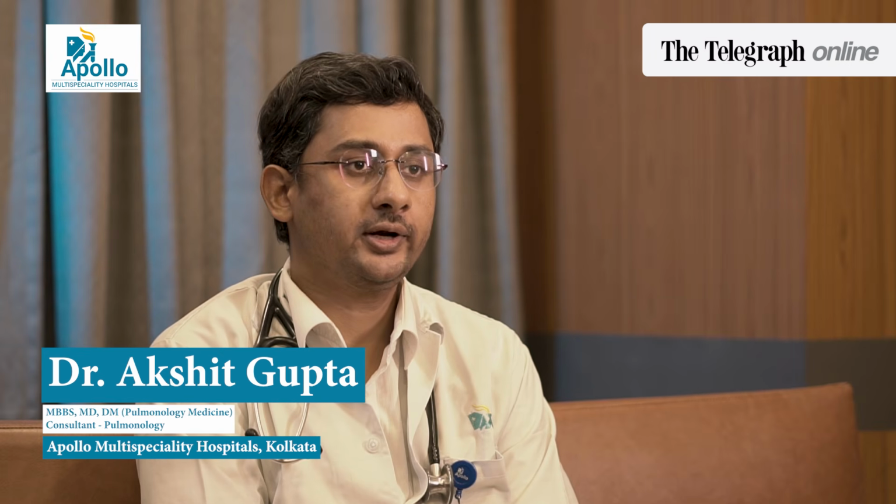I'll be talking to you regarding the two most common interventions that a pulmonologist does, that is flexible bronchoscopy and medical thoracoscopy. First, we will start with flexible bronchoscopy. Most of you would have heard about an endoscopy, which a gastroenterologist does to examine your gastrointestinal tract. Similarly, whenever there is a pulmonary complaint, sometimes a pulmonologist uses a similar sort of scope to look inside your lung and inspect your airways.